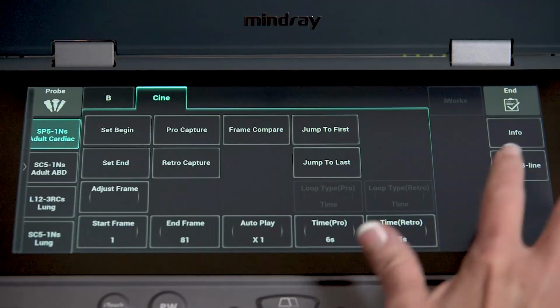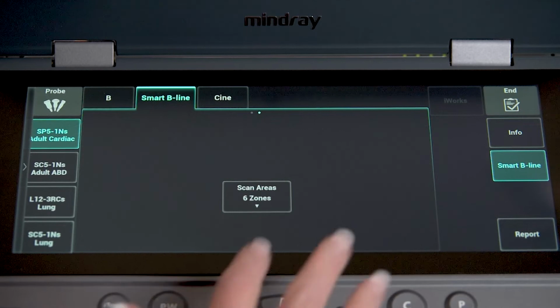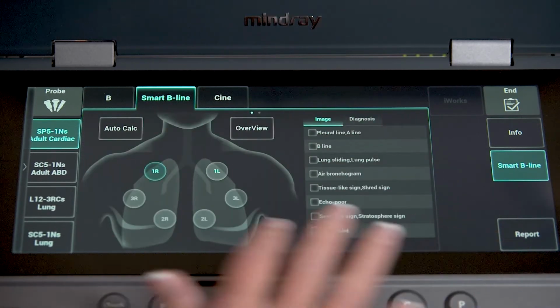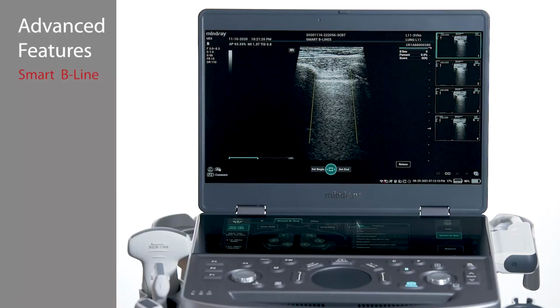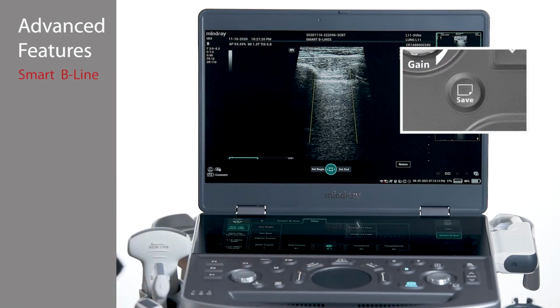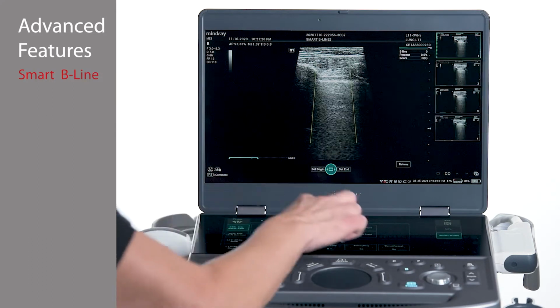Tap Smart B-Line to activate the Smart B-Line feature and select the desired lung map and zone. Obtain an image and select AutoCalc to start analysis. Press Freeze to display results, press Save to archive, and unfreeze to proceed to the next lung field.